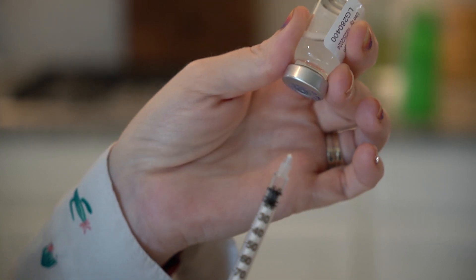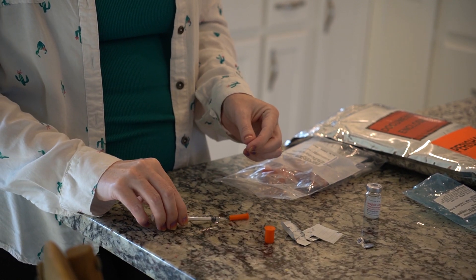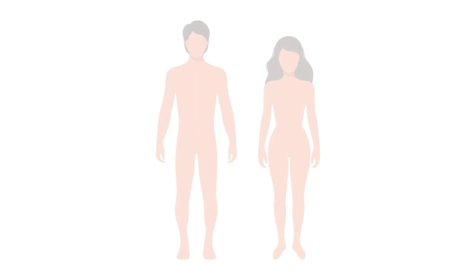Withdraw the needle carefully. Tap or flick the syringe to clear any air or bubbles at the top of the syringe. Carefully cover the needle by scooping it back into the cap.